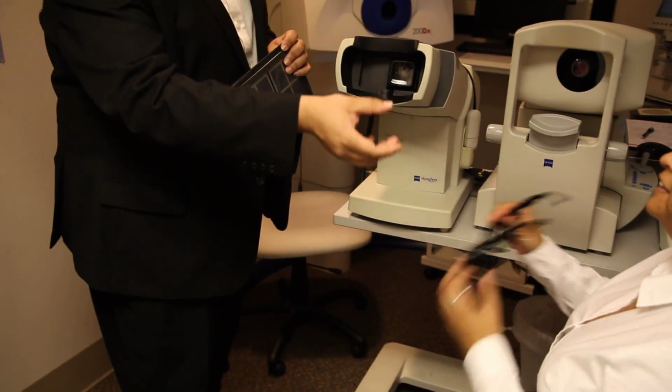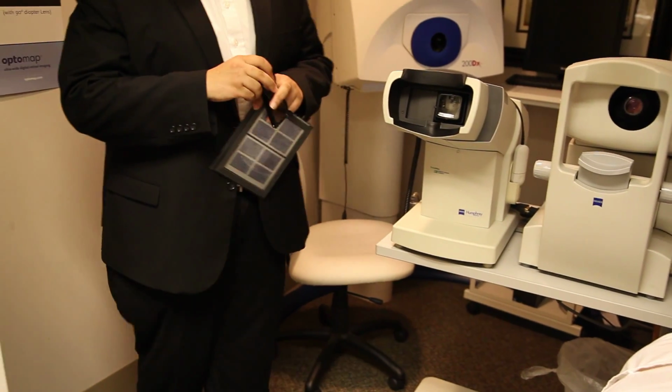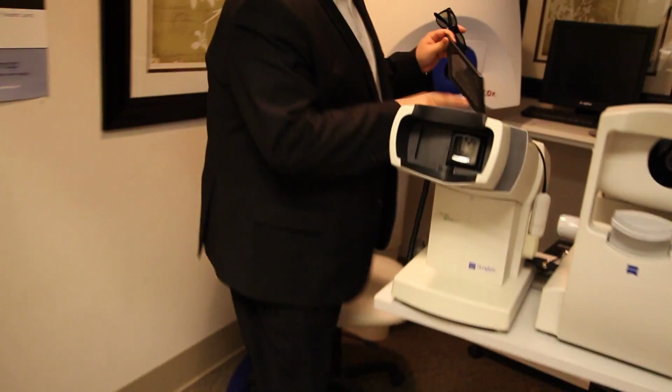Alright, and if I could have the sunglasses back, thank you very much. Now the answers for that test are going to be located right here on top of the visual field machine or instrument, and those are the answers.